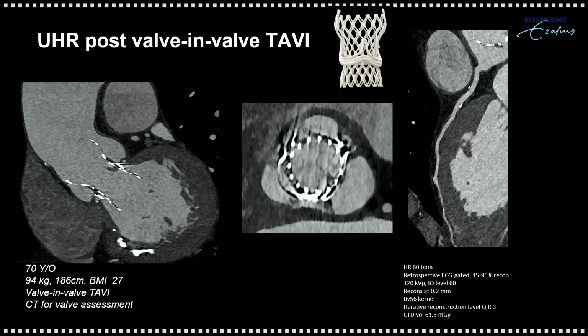And then, of course, the coronary arteries, again, showing the high level of detail from the plaques, the calcification here, even showing that that's not only calcification, but there is some non-calcified plaque on top of it.